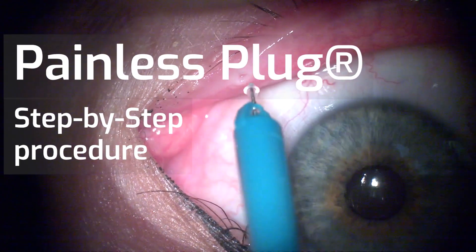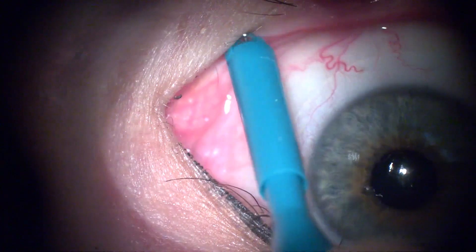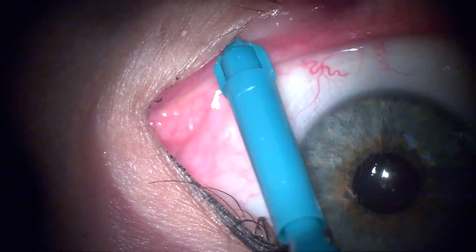FCI Painless Plug is an exclusive innovation used to effectively treat dry eye symptoms and greatly improve the patient's quality of life.